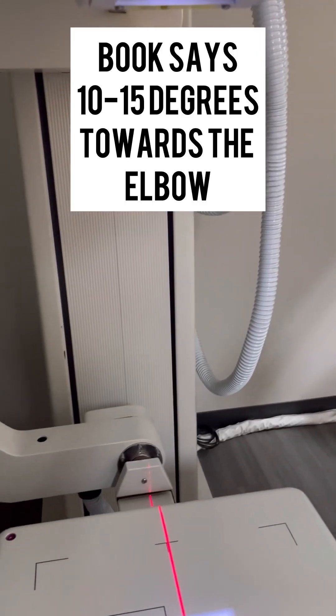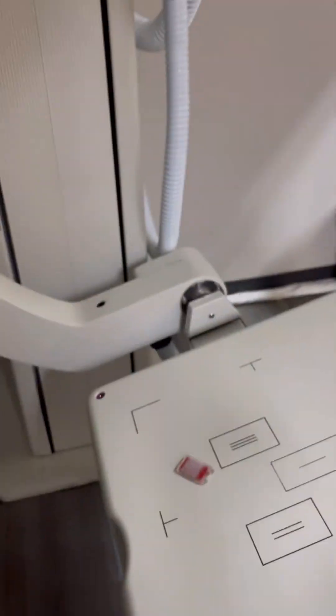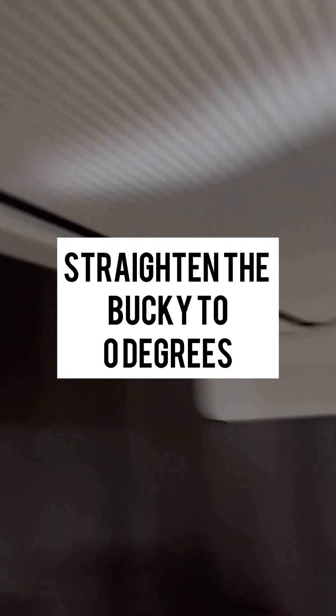For the scaphoid view, it is 15 degrees towards the elbow. Do it like that and then straighten this thing out.